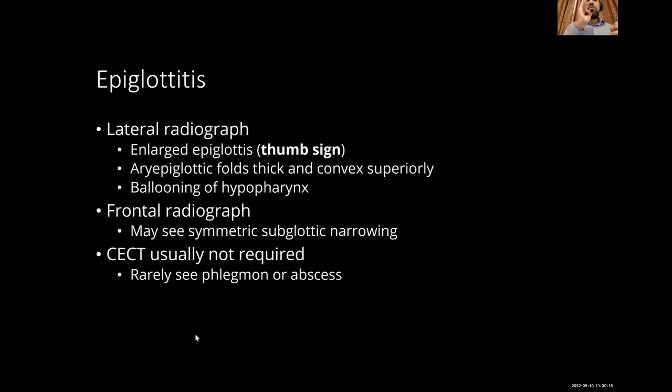But to call something an abscess, either there is a solid component with an internal cystic component, internal breaking down, and ongoing abscess formation, or there is a well-defined wall, not a pseudo wall or pseudo enhancement. Understand? I hope this is clear.